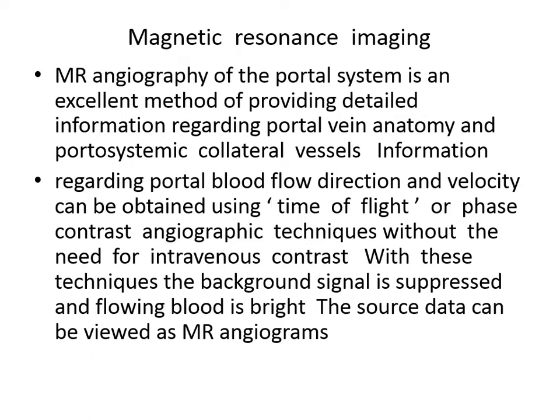If it goes toward the liver faster, it's not a problem. But if he is eating with a velocity of 12, this might be due to portal hypertension, slowing blood flow. Or he is fasting with a velocity of the blood flow like 5 centimeter per second. This is slow flow. It indicates portal hypertension.